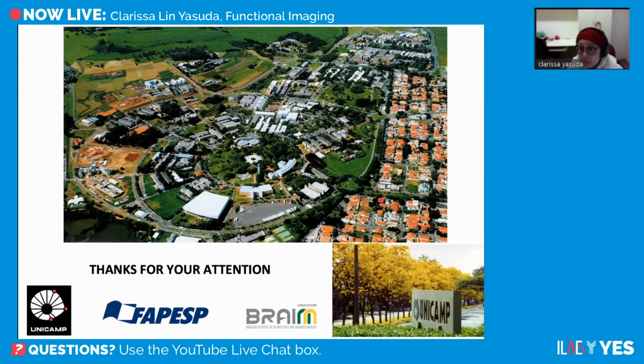We see a disruption of functional connectivity in patients with generalized epilepsy and with anxiety and depression. So you can use fMRI, especially resting state, to map some deficits. In psychiatry, there are many studies that use fMRI, even task-related paradigms, testing inhibition and disinhibition with many different paradigms in different psychiatric conditions. It's being widely used.